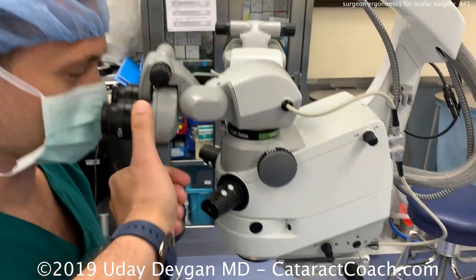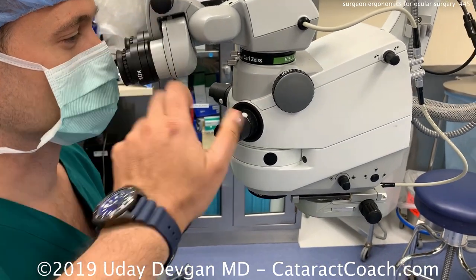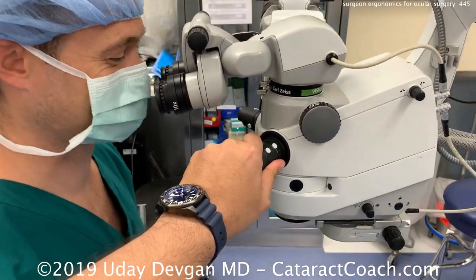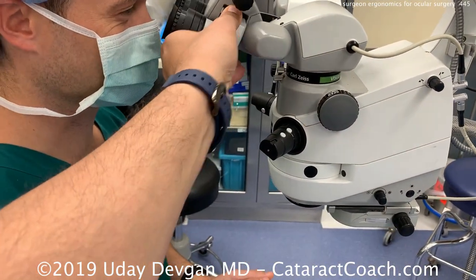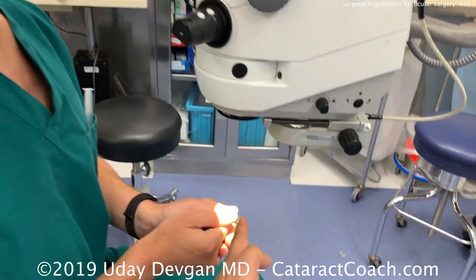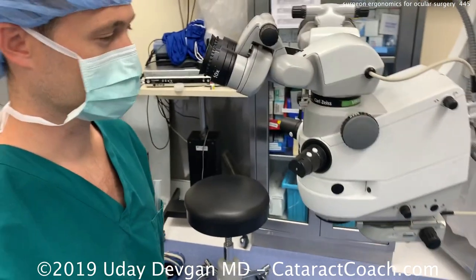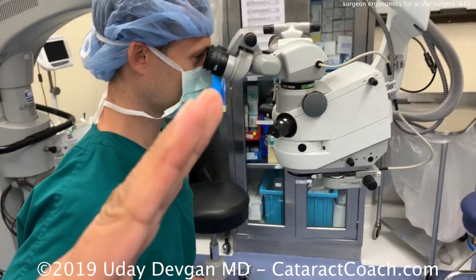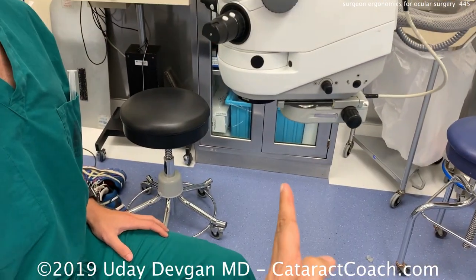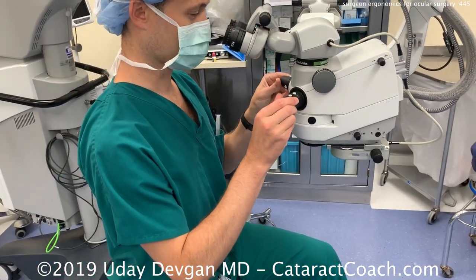Look down at the oculars at a specific angle — adjust it for your comfort. Remember, if you have the oculars more flat or parallel to the ground, the scope height changes very significantly and that puts you in the uncomfortable position of looking up. I like a slight downward tilt — that's most comfortable. The body stays nice and straight with hands in good position. If the scope is a little bit farther away from you, you'll have to lean forward and that puts strain and stress on your back.